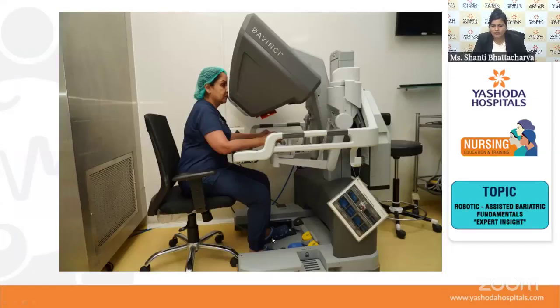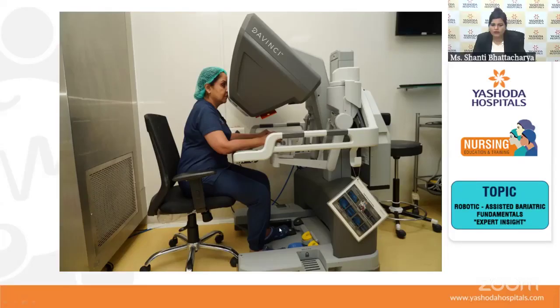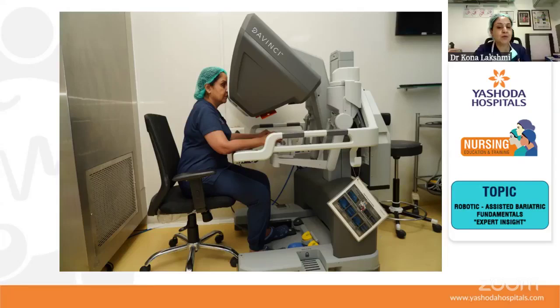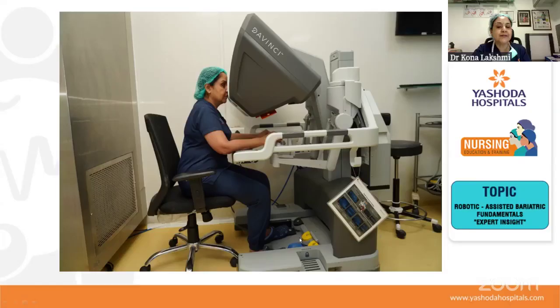And what about the functioning of the legs, ma'am? It is like putting on the brake and clutch. On the left side, my foot is on the camera pedal. In laparoscopy, the camera is held by an assistant surgeon. Here, the camera is held by the robo and the movement is controlled by my left leg. And on the right leg, you see those yellow and blue pedals. Those are the energy pedals, one bipolar and one monopolar.